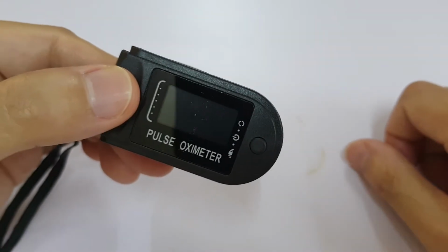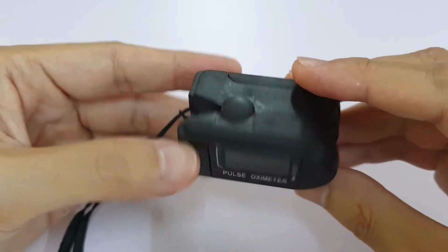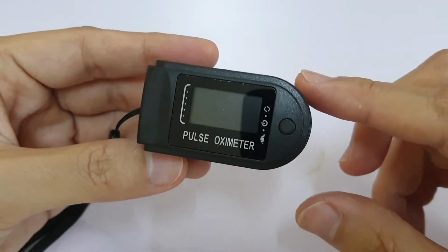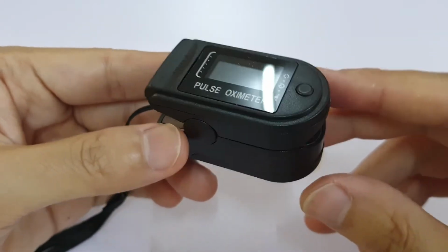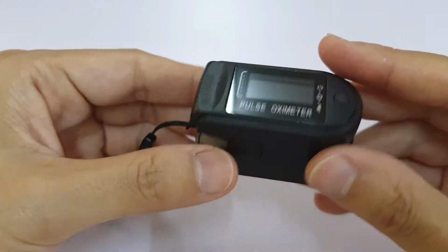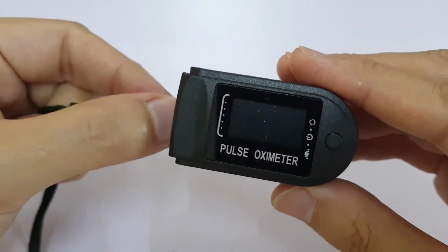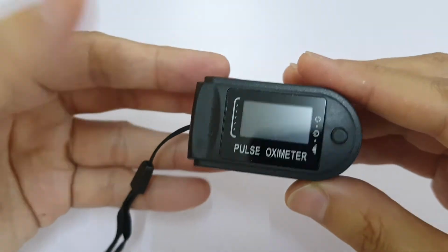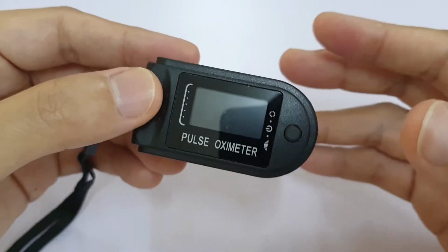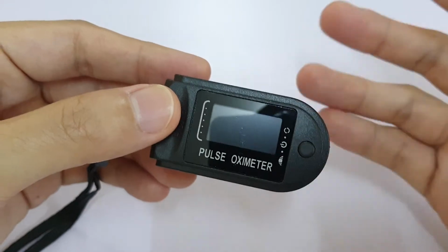Now what I want to do is compare this as a viable device. Every household should, and I strongly recommend you to get one of these. It only costs like $5 US. Battery is separate. Two AAA batteries won't cost that much money, and this can quickly tell you your oxygen levels, especially nowadays when there are people who are not symptomatic, and you don't want to get a last minute surprise, or that one person cannot breathe.